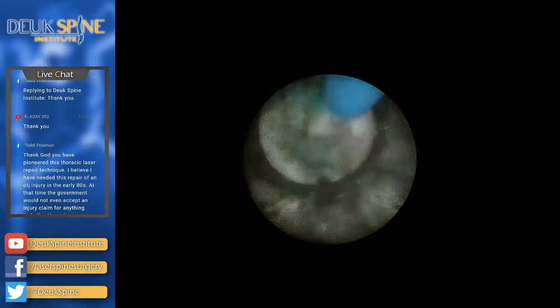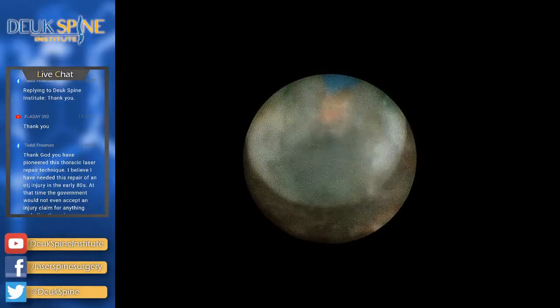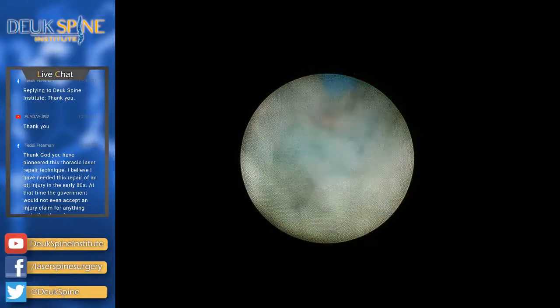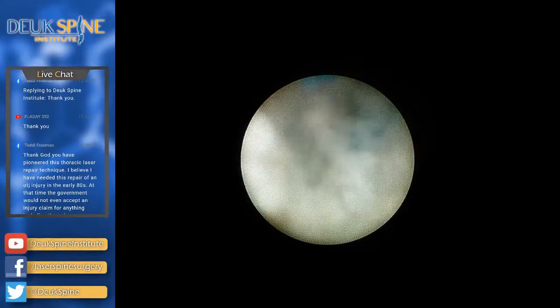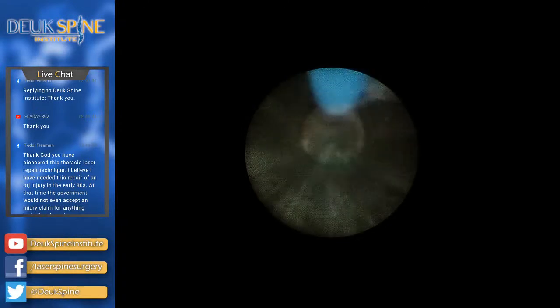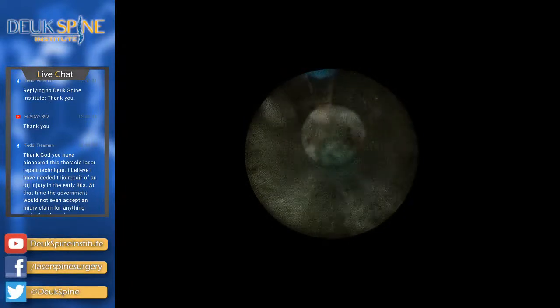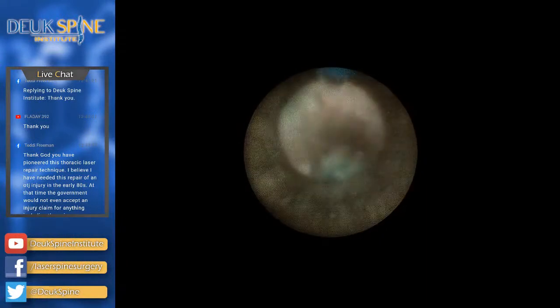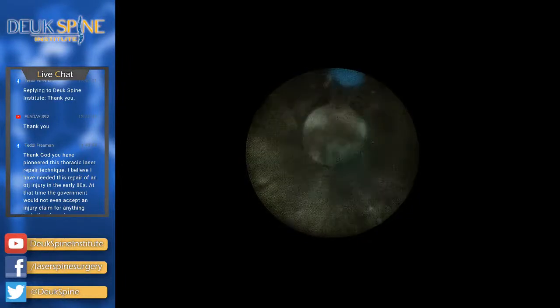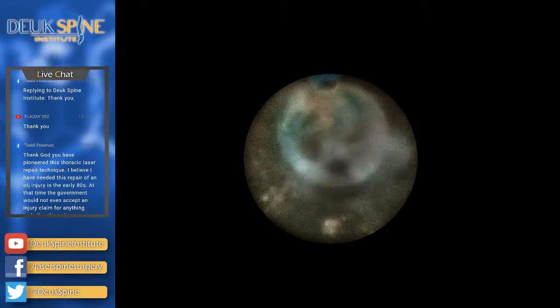Yeah, well, we're getting to the outer part of the disc where there are more pain fibers, so he's going to be more responsive. He's got an itchy nose? All right. Is he comfortable then? He looks comfortable. Yeah. All right. As long as you're happy, I'm happy. He's not moving so much as bothering me, but I want him to be comfortable. Again, I'm pulling out a little bit, and eventually we'll be done. And we're not far from being done. But as I was saying, I want to make sure that we get everything we need to get treated here. So he has a great result.